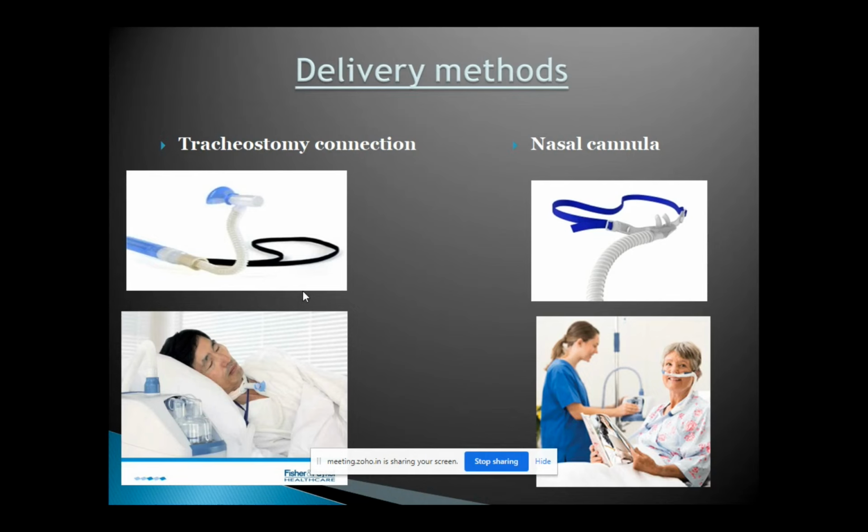So you may say, oh, I'm giving the oxygen via cold bottle humidification. We discussed that's not the right way of humidification. Humidification involves 37-degree body temperature, because that's what normally happens to us. It doesn't matter what the outside temperature is. For example, in the UK at the moment, the room air temperature is 15 degrees Celsius.